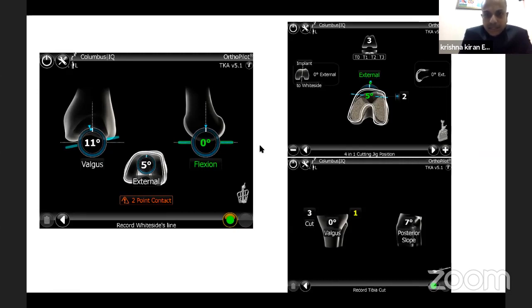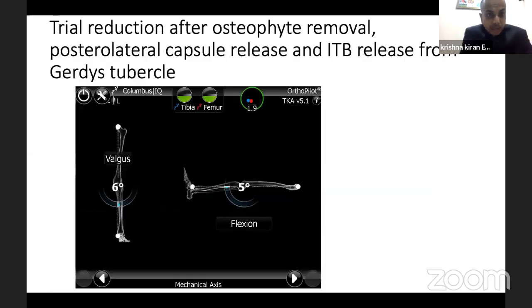And Dr. Mohanty rightly said, we must take a limited amount of tibial cut in these cases in order to compensate for a lax situation which might arise later on. So 3 millimeters from the medial side was removed, at a 7-degree posterior slope as is done normally for cruciate retaining knees. So when do you choose to do a lateral partial condylar slide?